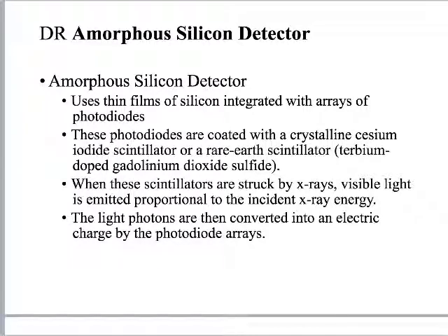Okay. Amorphous silicon. So we're going to use this silicon basically to conduct a signal, right? So it interacts with the crystal, gives off the light, and the silicon there picks up the light and allows it to conduct a signal to the TFT.